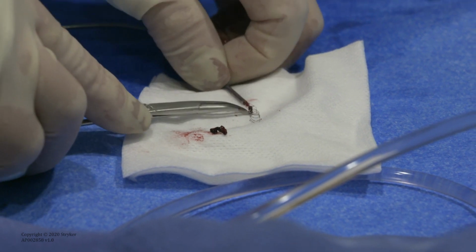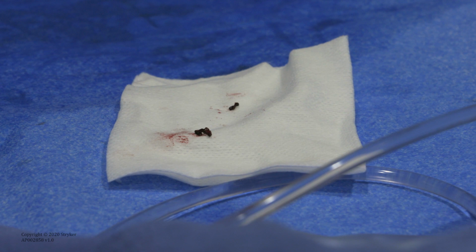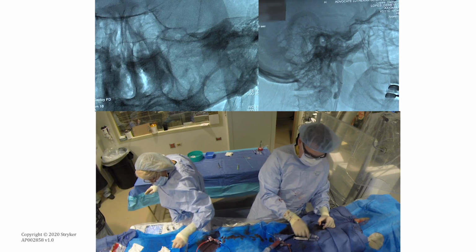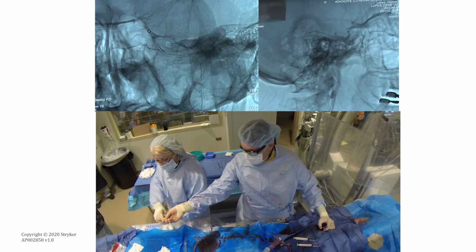You can see how well integrated it is, hard to remove, and very much trapped in there. Many times, depending on the type of clot, you also have more of a component on the Cat 7, but in this case it was very much connected to the stent retriever.